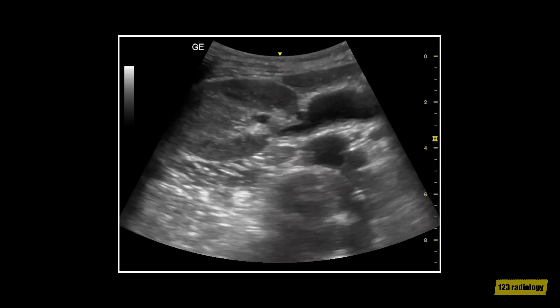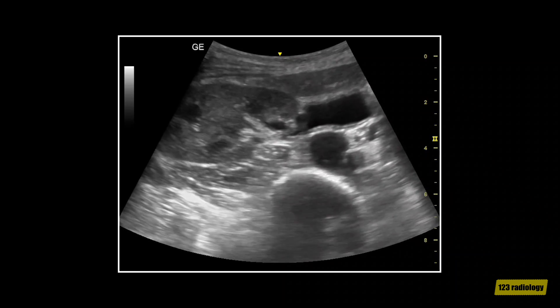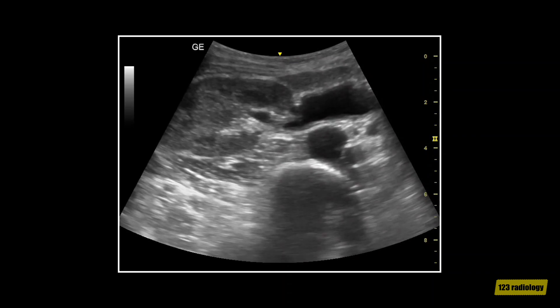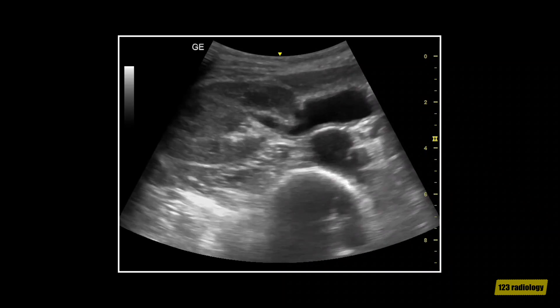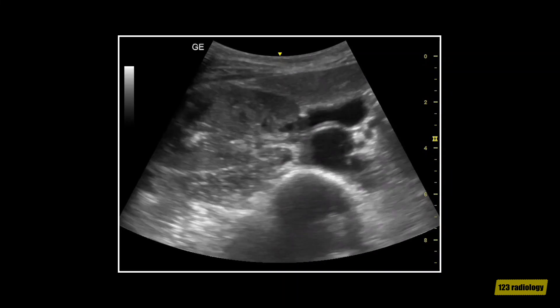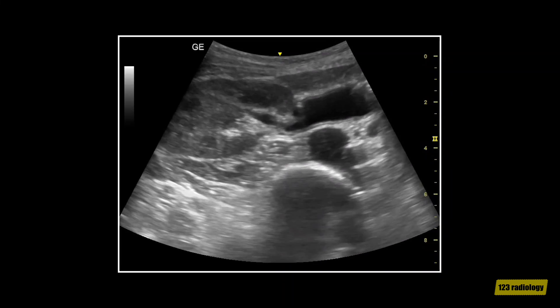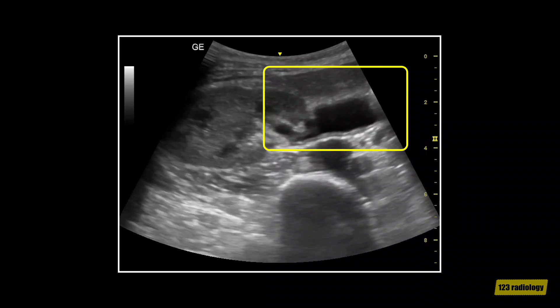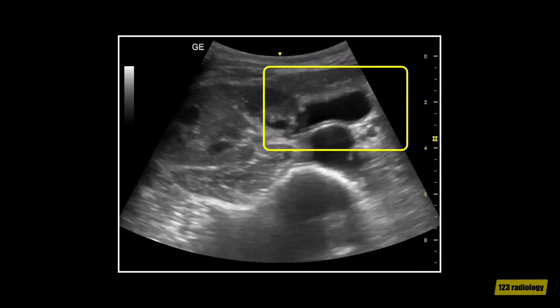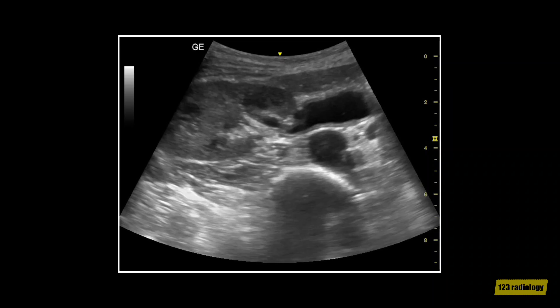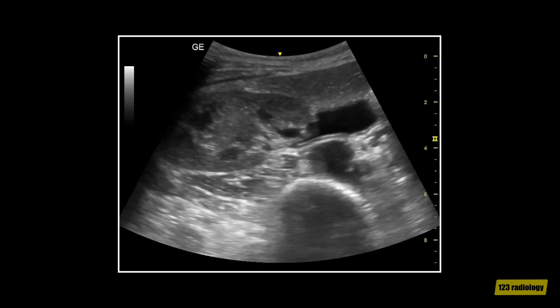This video clip shows another case of extrarenal pelvis. This is a transverse view of the right kidney through the renal hilum. The renal pelvis is extrarenal and is dilated. Again, the calyces are not dilated.